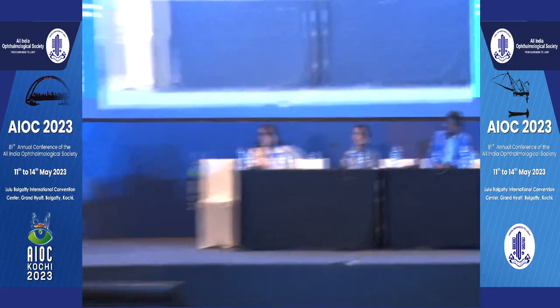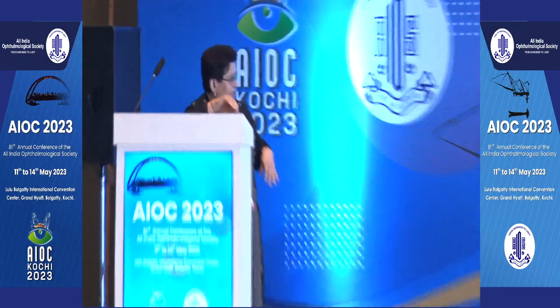No, I didn't get your question. For the first case, the expulsive hemorrhage. Yes. When you operated for the expulsive hemorrhage after 15 days, into the vitreous cavity, you inject the PFCL and leave it for some time so that the entire blood in the suprachoroidal spaces... you don't do it. I have not injected PFCL. I don't do that. I leave the infusion on and made the opening on the outside, drained off all the fluid, and then went and did the vitrectomy from inside.